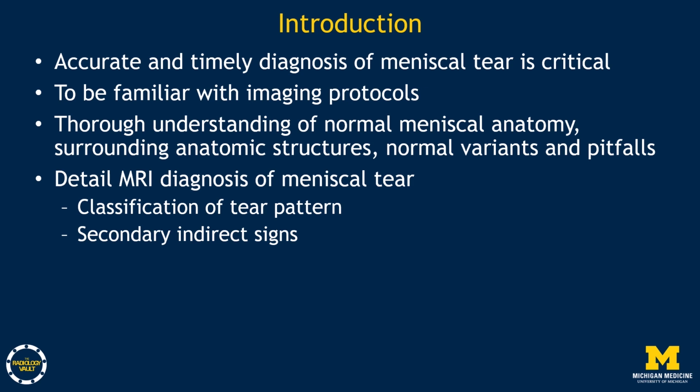It requires radiologists to be familiar with imaging protocols, thorough understanding of normal meniscal anatomy, surrounding anatomic structures, normal variants, and pitfalls. Detailed MRI diagnosis of a meniscal tear, including classification of tear pattern, can guide the referring physician in patient evaluation and surgical planning.